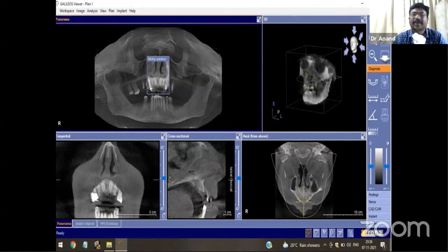When you open the CD, they will have an application file. When you run the application file, it helps you install the software on your machine, and then you can easily open the software and you'll have a screen like this. Then you start to play around, and you'll get to know more about the software. But the versions given along with a CD would be a limited function shareware. What do you mean by limited function shareware? It's nothing but that all functions present in the primary software would not be shared with a third party.